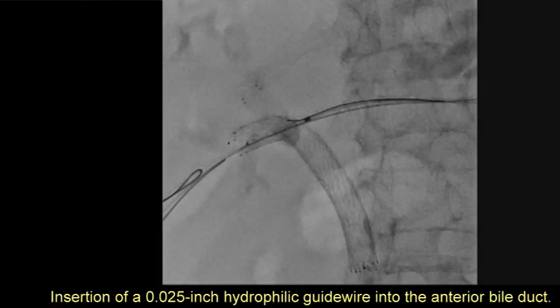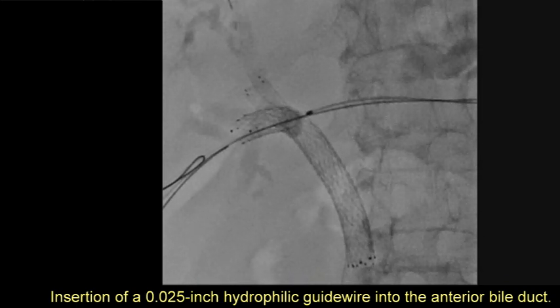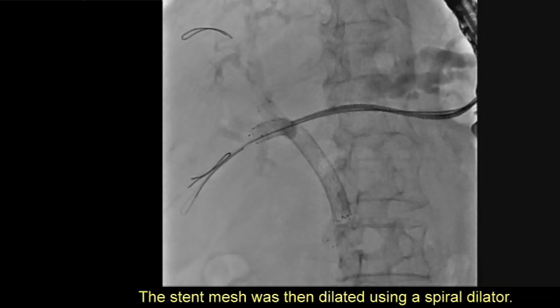A 0.025-inch hydrophilic guide wire was inserted into the anterior bile duct, and the stent mesh was then dilated using a spiral dilator.